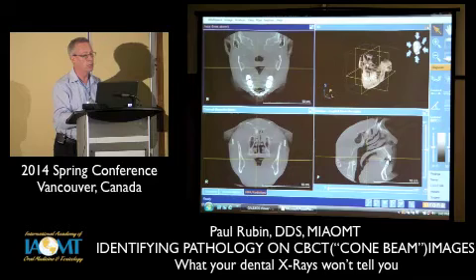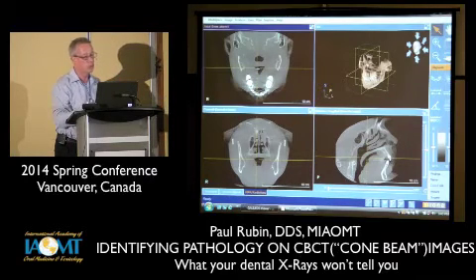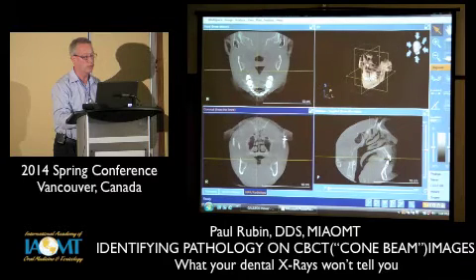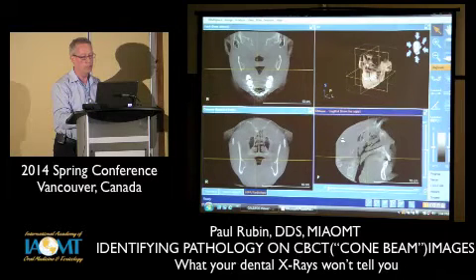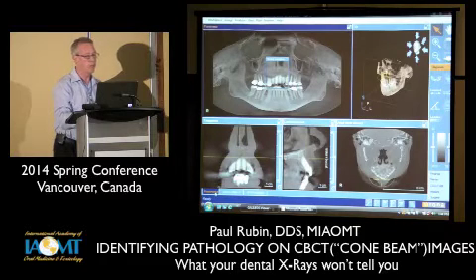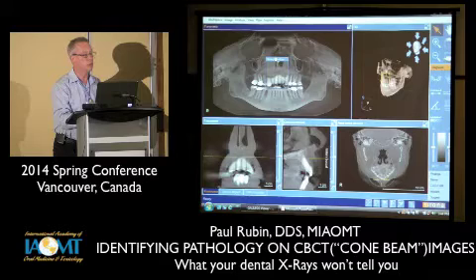You can see the same image where we are exactly here on this image on the upper left is also showing down here in the coronal view, etc., and the sagittal view. So you have different ways of looking at this image. On this coronal view, we can look as if we're going from front to back, scanning through slices this way. On the sagittal view, we can scan through slices this way. If we go back to the panorama view, this is probably one that gets used more. We're using this slicing window to look at specific smaller areas that we want to investigate.